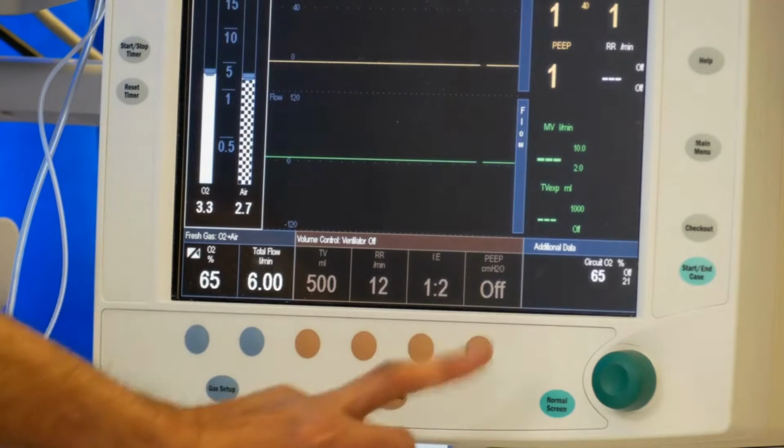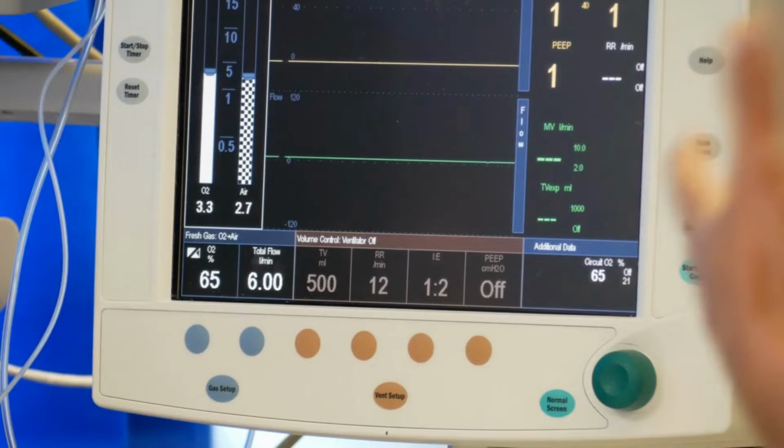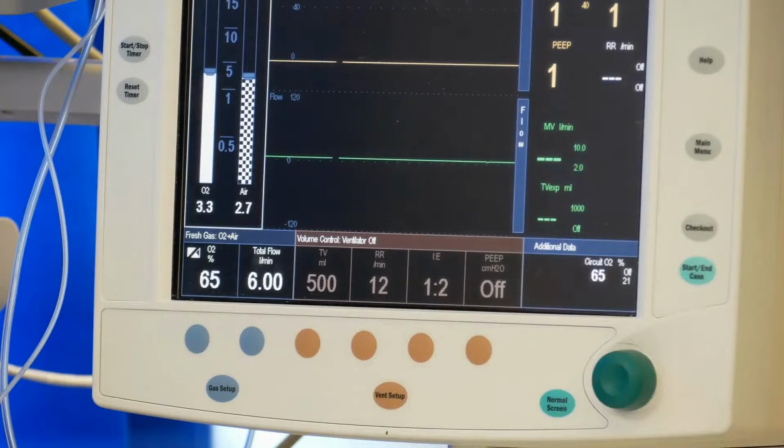Lalit, when I'm here to look after this patient, you would not expect me to be doing anything on the dials. If I'm in doubt that the patient is not doing well, I would be calling for help and getting you to come and do what is needed. Yeah.